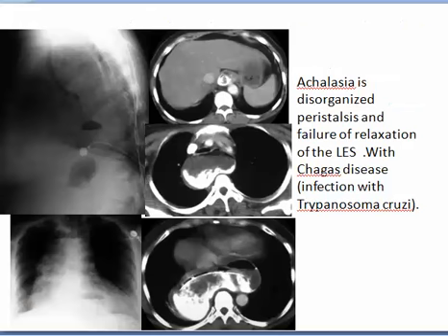Now we have a very big structure here posteriorly, displacing the trachea anteriorly and showing a fluid level here. And during swallowing of barium, the barium rests as sediment posteriorly in a very large, viscous, sigmoid-shaped esophagus, and here you have a fluid level, and here is another fluid level. Usually this appearance is of hiatal hernia, but this appearance is of achalasia. But sigmoid dilatation of the esophagus can produce such things.